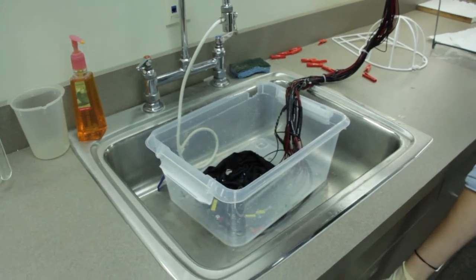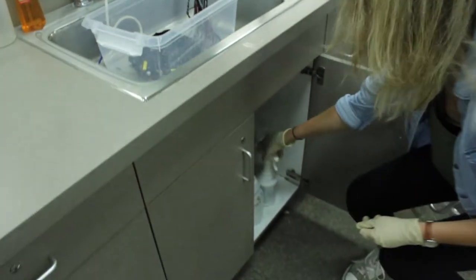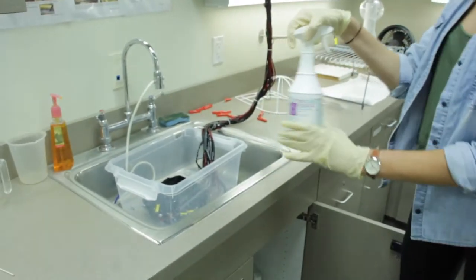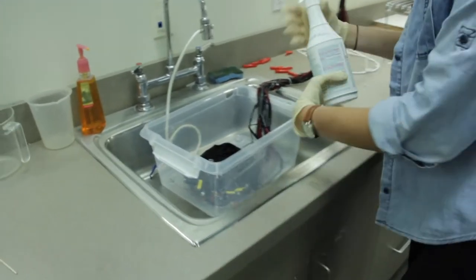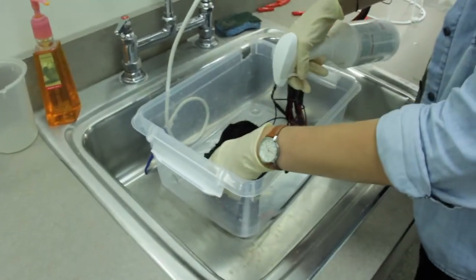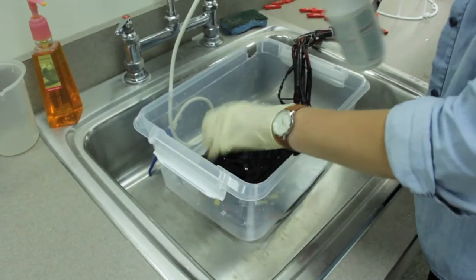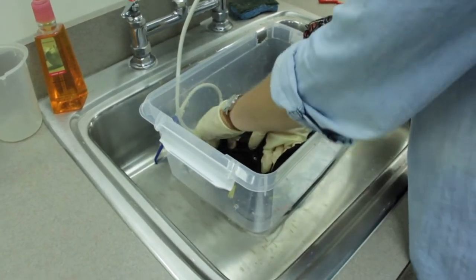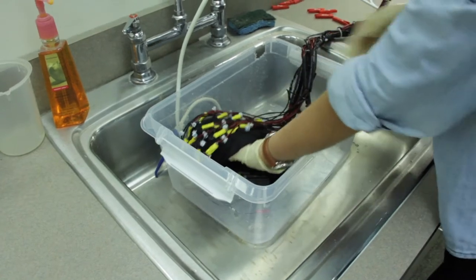After you have rinsed the cap with clean hot water, disinfect the entire cap and electrode surfaces with enviricide, located underneath the sink. Spread the enviricide all around the cap and don't miss any electrodes. Let the enviricide sit for at least 3 minutes before washing it off.